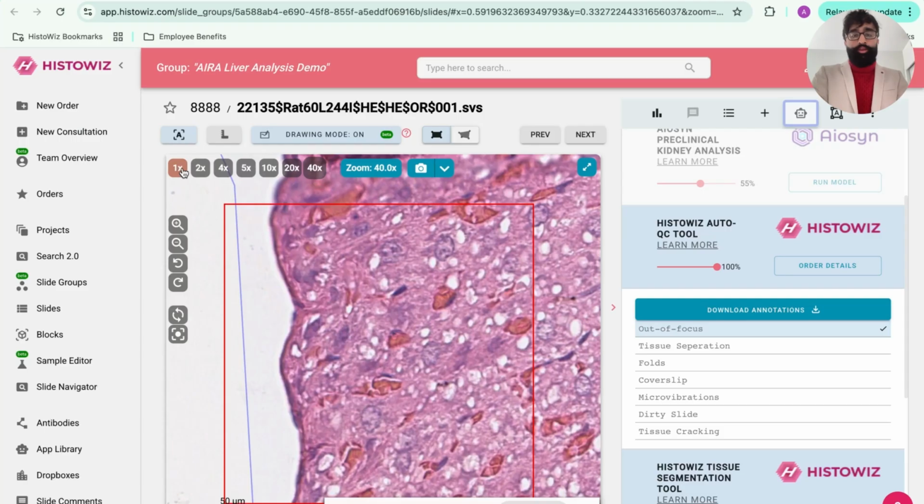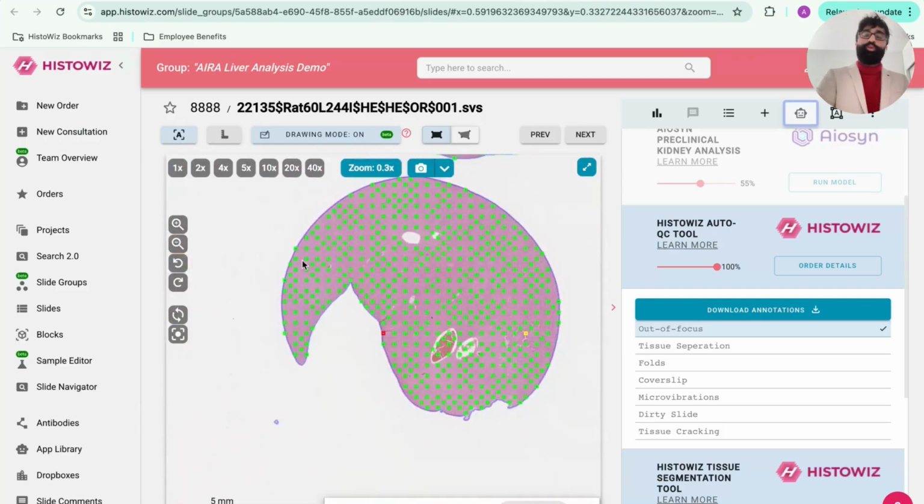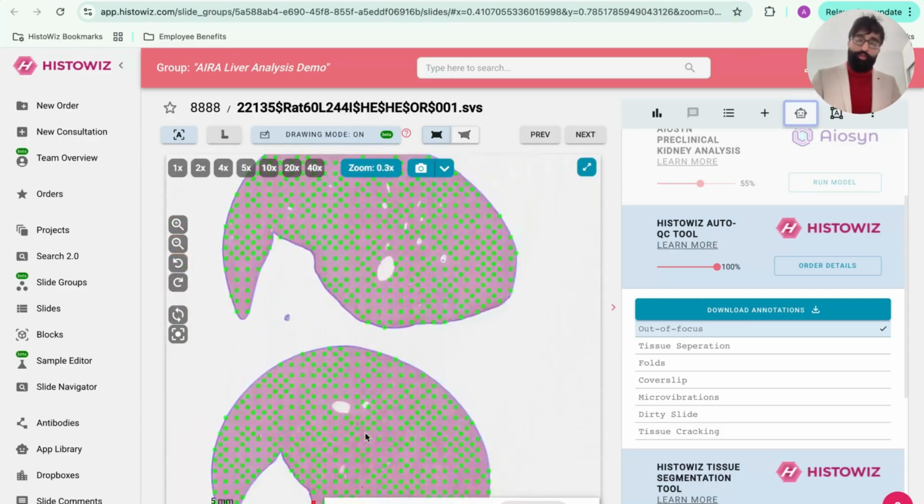Again, it depends on researchers as to how critical a QC issue is for them. But not just for the researchers, even for AI companies, QC has been incredibly useful, because they want to run their AI on good quality regions. And if for a certain reason it gives X percentage of accuracy or AUC, they want to know that it has come from the good quality regions within the image and not the bad ones.